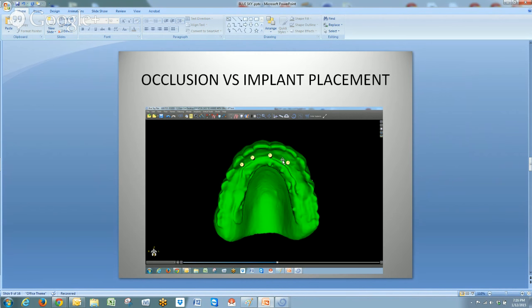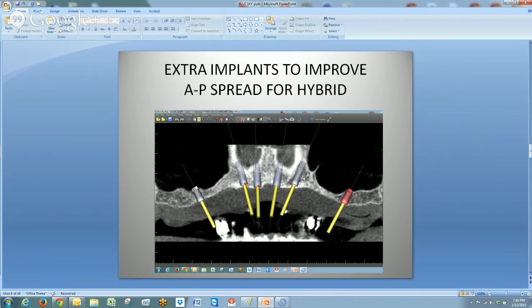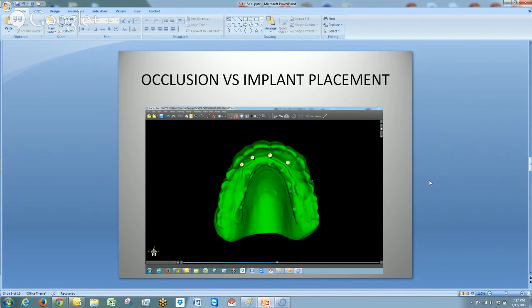This is the locator design. You can see the AP spread goes from the right canine to the left lateral — simply because the sinuses wouldn't let us do it any differently. We don't have a lot of bone thickness and we wanted longer implants to support the case better. This is as far toward the sinuses as we could get those implants on both right and left. For a locator case, that works fine — we can make a successful locator case with this design. However, this is not a good enough AP spread if we opt to go to a fixed case, whether it be crown and bridge or a fixed hybrid non-removable by the patient.